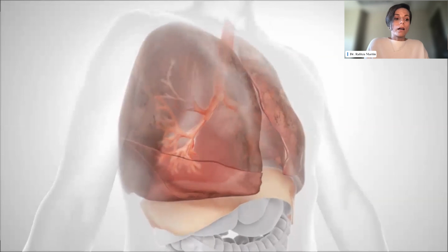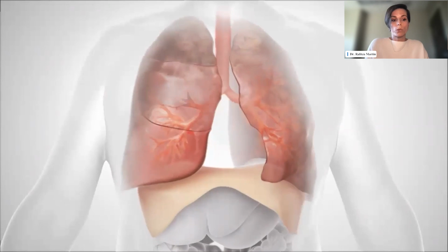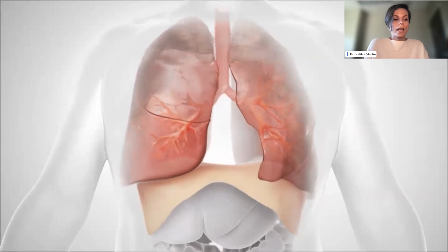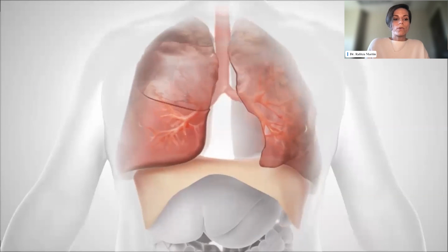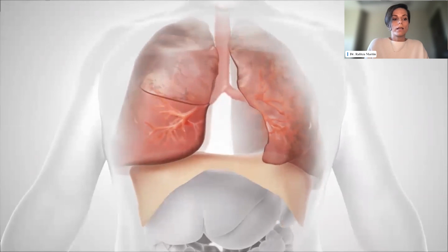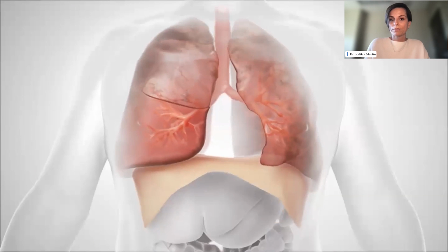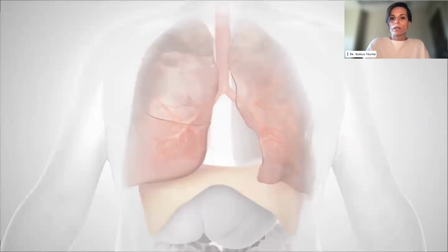The remaining lung also has a better elastic recoil, which leads to improved expiratory airflow. And with that, we're also able to reduce the variation in regional ventilation and perfusion, and it leads to a better matching and alveolar gas exchange. So this video was just a quick visual on how the valves work and how over time the trapped air gets released, which leads to the clinical benefit.